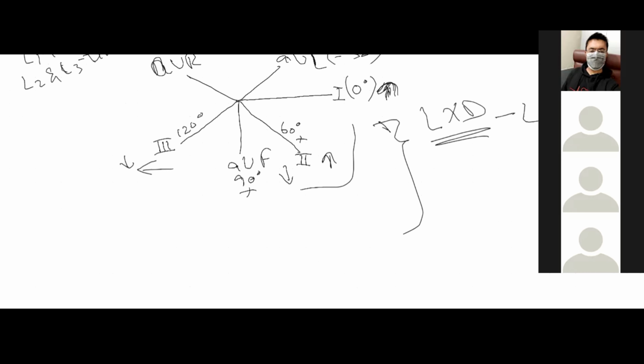Lead 1 will be positive, whereas lead 2 and lead 3 will become negative.